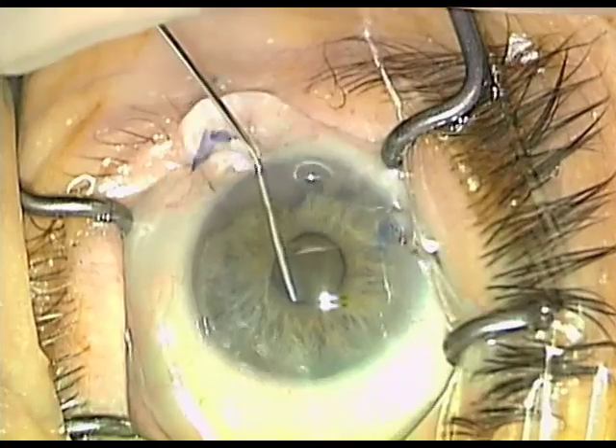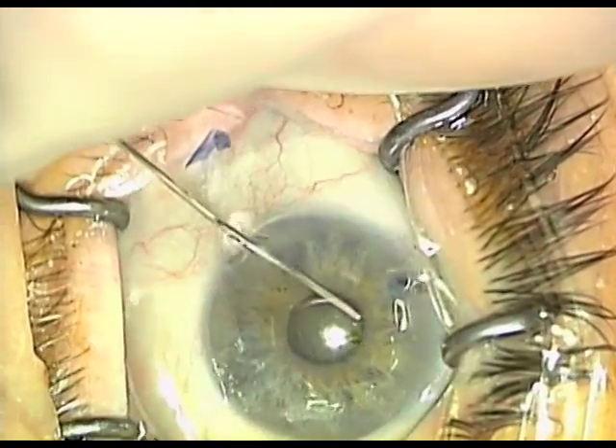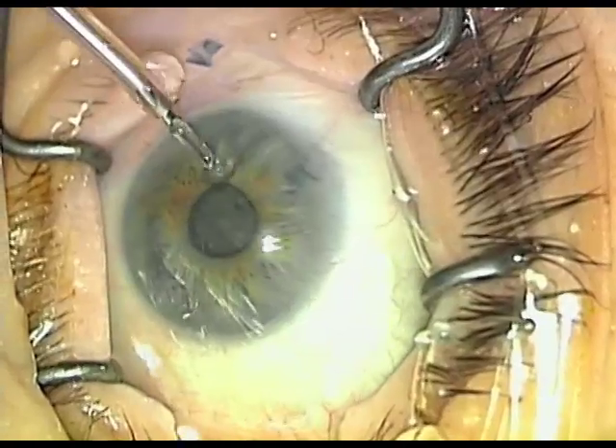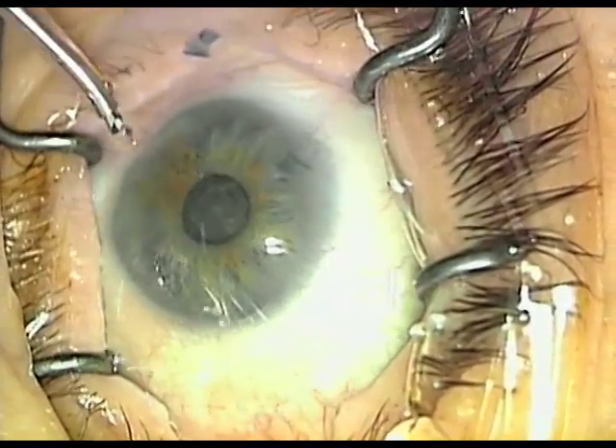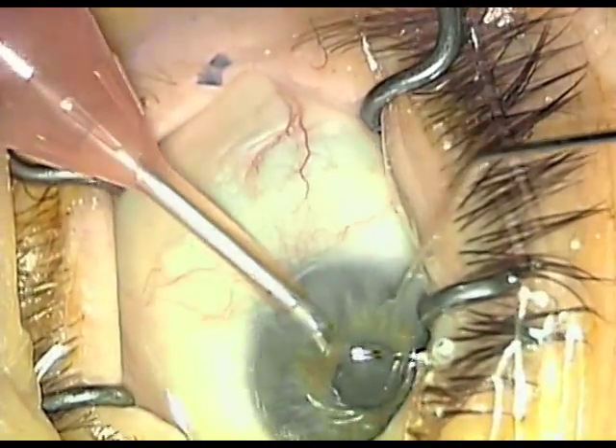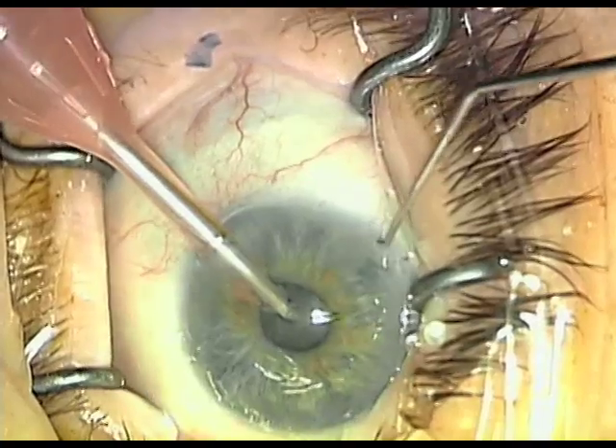The pupil is left small here. We leave the hydrodissection cannula just underneath the visible rim and we perform a very important hydrodissection. If we cannot achieve hydrodissection, we will be required to stretch the pupil further.